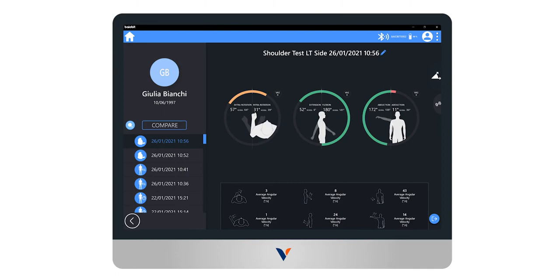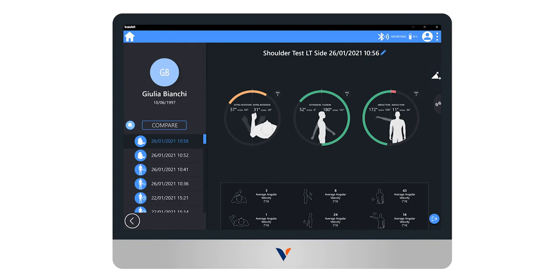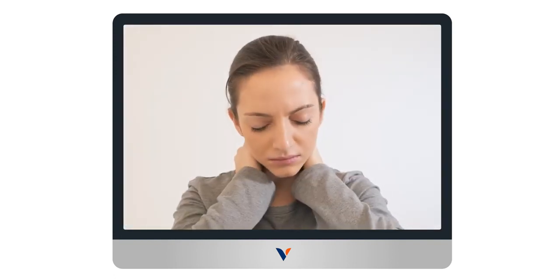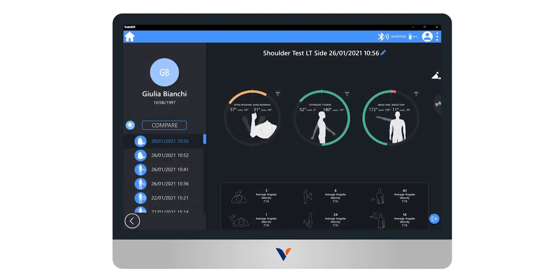The range of movement measurement is particularly useful in the functional examination during the rehabilitation of shoulder trauma, disabling pathologies such as the degeneration of the rotator cuff structures, or during the evaluation of the patient with cervical problems. It is also particularly useful in the objective comparison of joint range of motion before and after the treatment, in highlighting changes in range of motion in different physiotherapy sessions, in comparing the range of motion of active and passive movement, or the amplitude of the gesture by performing corrective tests of the movement kinematics.